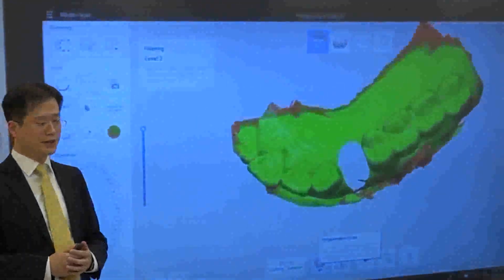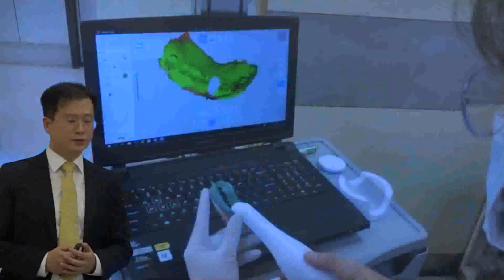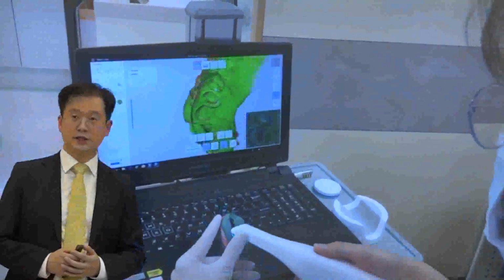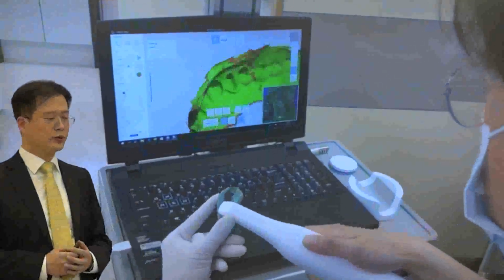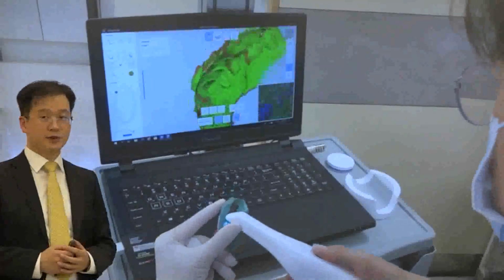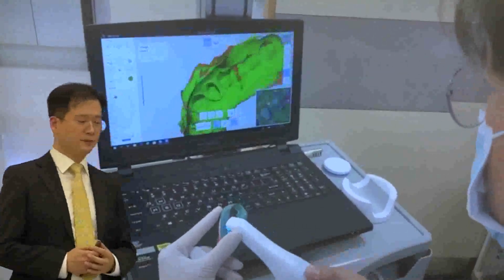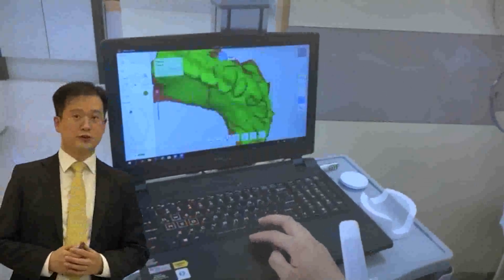Among the intraoral scanners, I use the i500 scanner in my hospital. This system can additionally scan impression bodies instead of directly scanning poor areas such as bleeding teeth or bleeding gingiva, allowing us to take advantage of physical impressions.